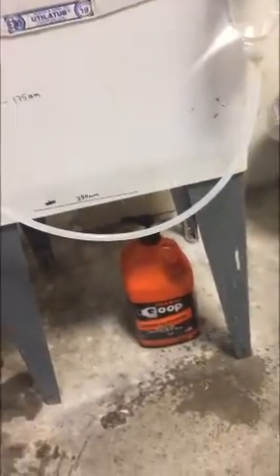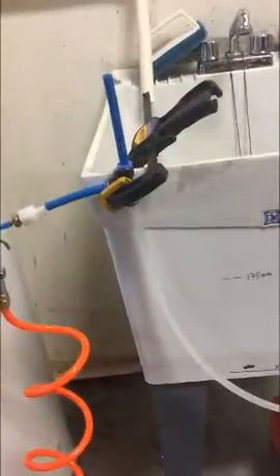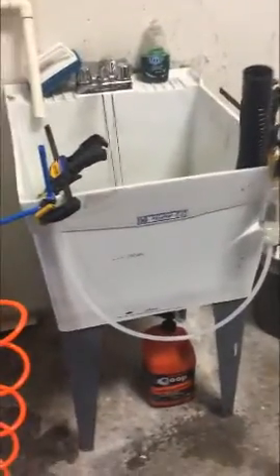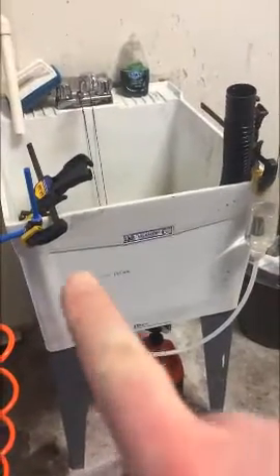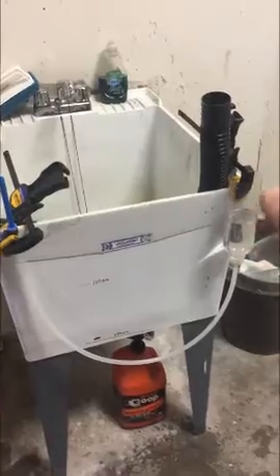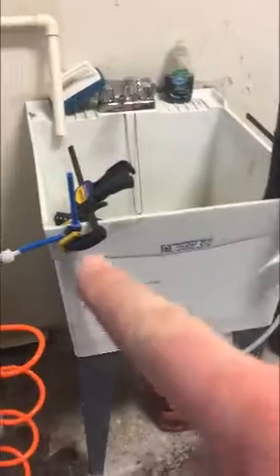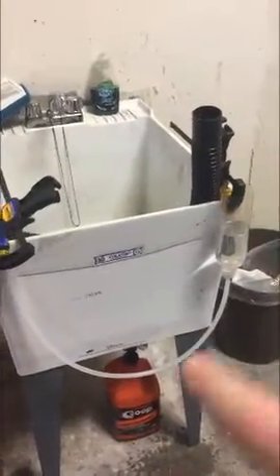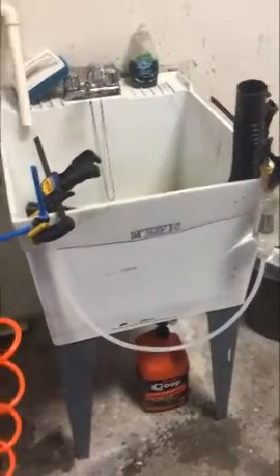So I've made the tube a little bigger, so the bottom of the tube is 40 centimeters below the water level in there. So my overpressure mechanism is that if the patient isn't breathing in, the water level in the tube will drop all the way down, and at some point it'll just start bubbling up the top, and that acts as a pressure relief. And then as soon as the cycle stops, the water in the bottle just flows back and refills it. So it's an overpressure valve that closes itself.